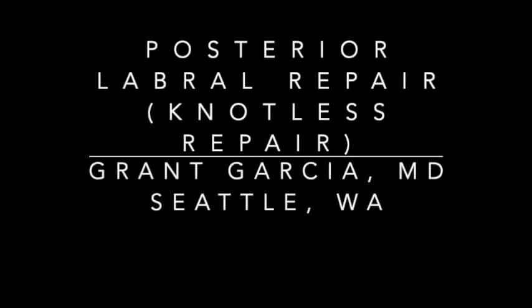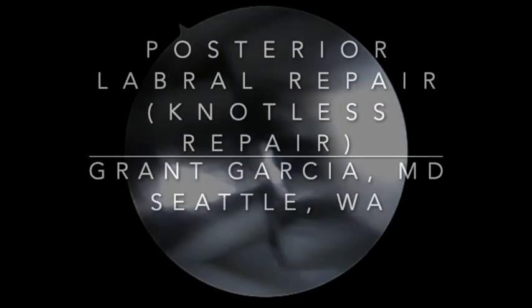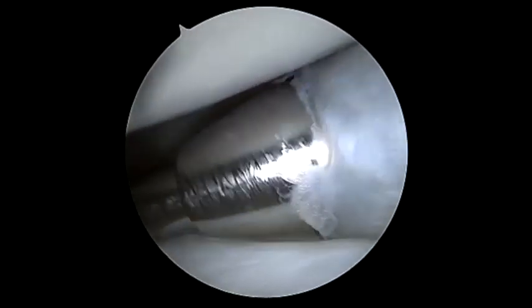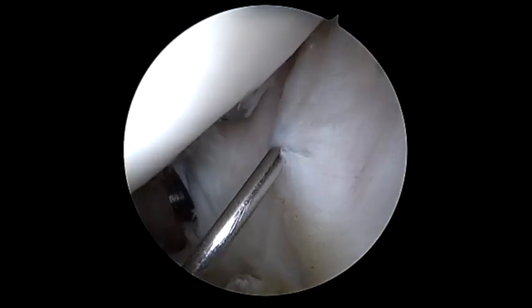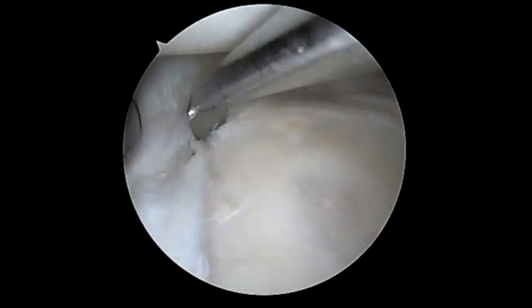Today we're going to demonstrate our technique for low-profile complete knotless posterior labral repair using the new knotless fiber tacks. Here we're placing our portals using a dilator and 8.25 cannulas. We view from an anterior superior portal and make this by inside-out method as seen here. This technique is quite helpful as we have good viewing of the posterior labrum.